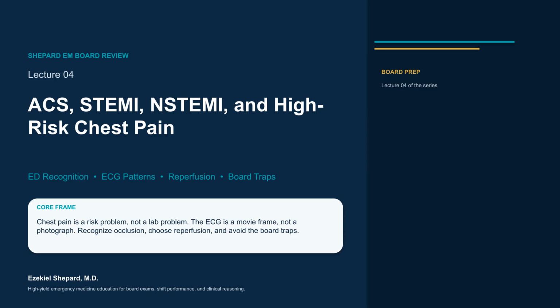All right, this is acute coronary syndrome, STEMI, NSTEMI, and high-risk chest pain. This lecture is about the emergency physician's job in the first minutes. Recognize the patient who needs immediate reperfusion, identify ischemia that does not meet classic STEMI criteria, start the right medications, and avoid the ECG traps that delay cath lab activation.